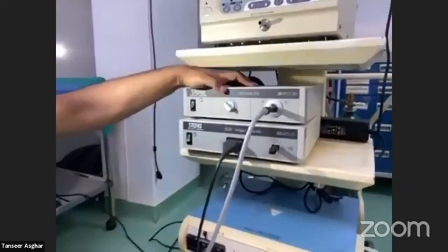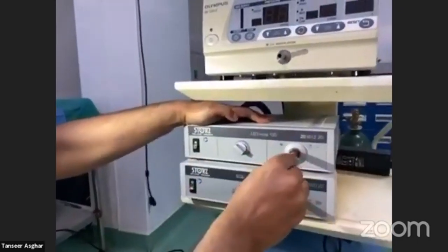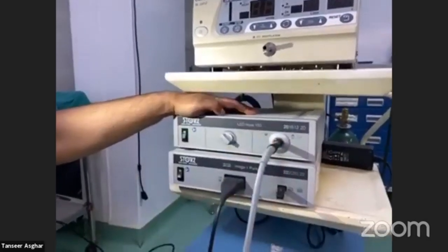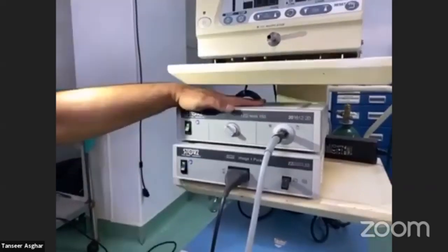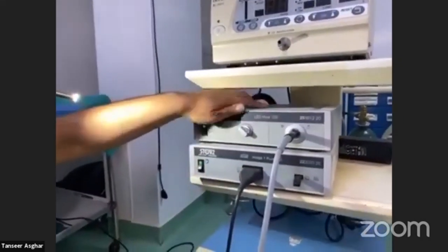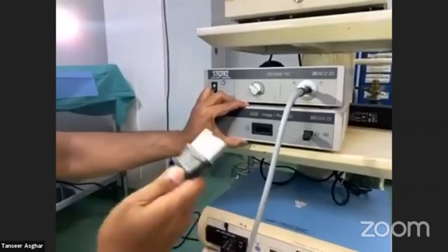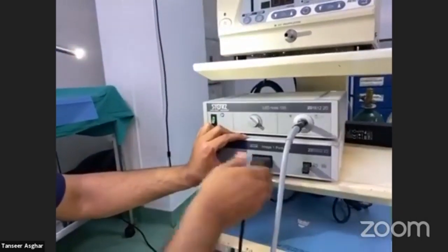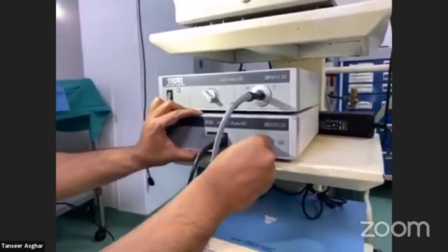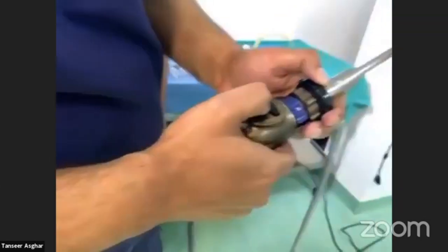Looking at the light source: it has a switch on and off button, a button to control light intensity, and a port where you insert the light source cable. This is an LED light source, though Xenon light sources also exist. The CCU or camera head unit also has a switch on and off button, a socket for the camera head knob, and a USB recording system — attach a USB drive and press the record button for a few seconds to start recording.